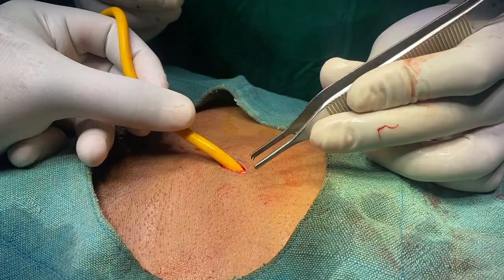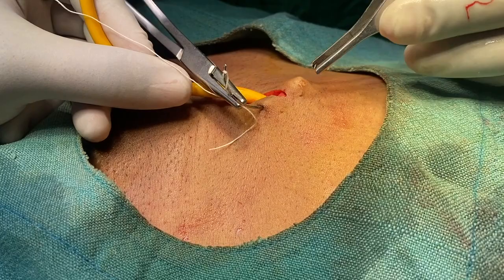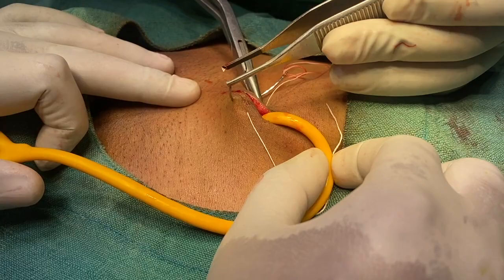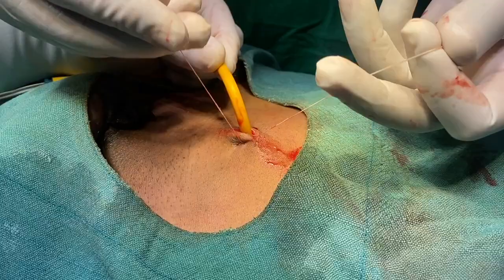Although this catheter has a self-retaining balloon, I never rely 100 percent on the balloon alone. In all my suprapubic cystostomies I anchor the catheter with a suture. This suture remains there for around two days, after which we remove it. This is a box stitch, which also has some haemostatic effect.